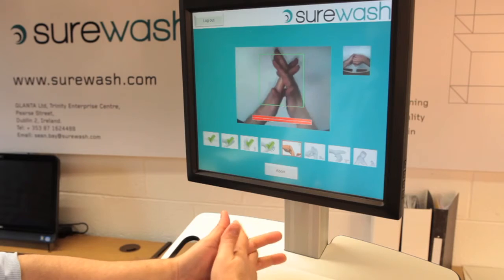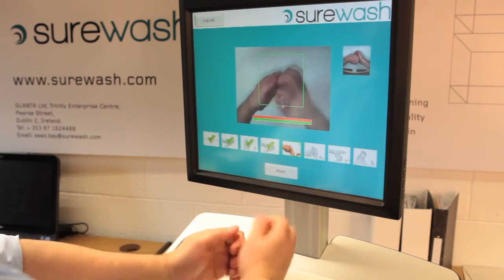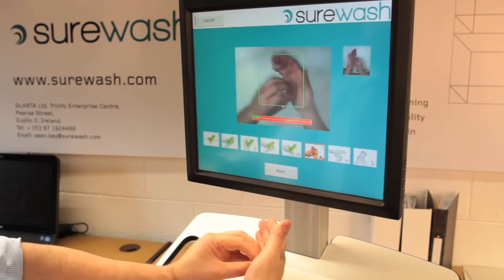And you can see the bars on the screen here move from red to green as your hands have been in the correct pose for the correct length of time. If you are doing a pose that is either incorrect or is not matching the pose that the system wants you to do at that time, it doesn't allow you to progress.